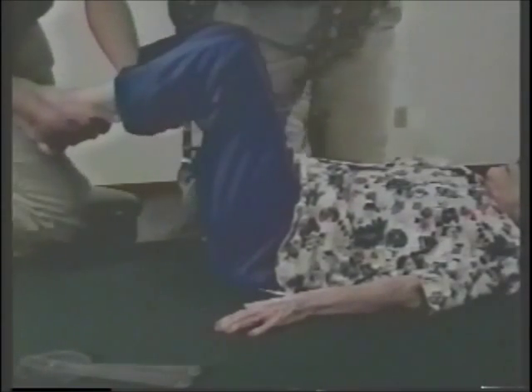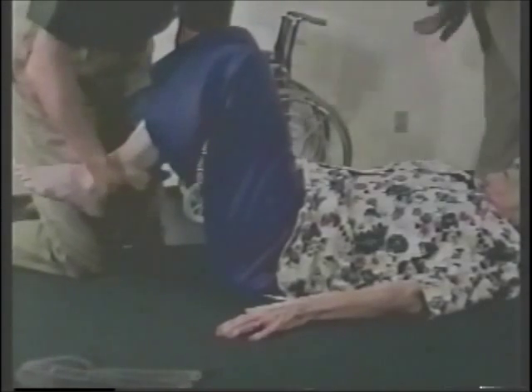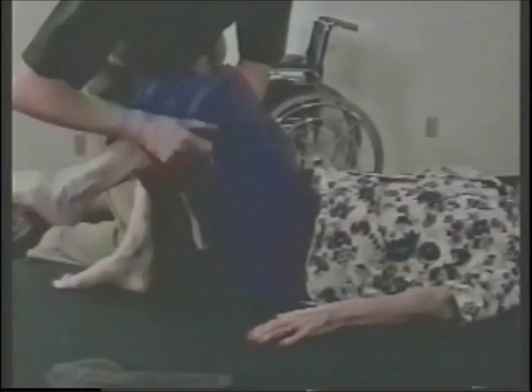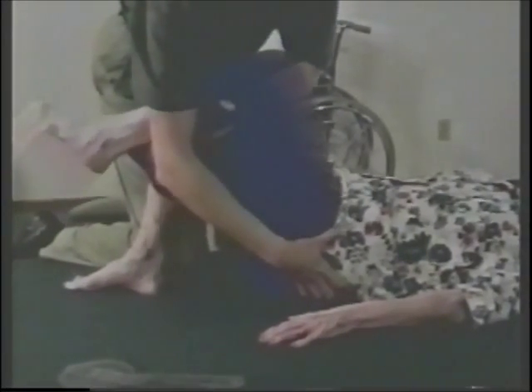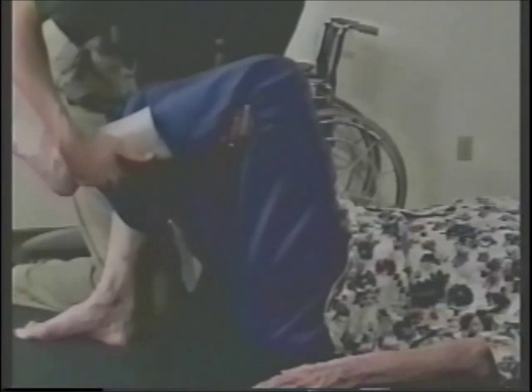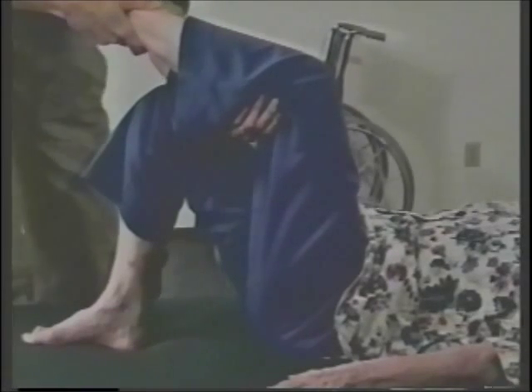The next part of the evaluation is looking at the knee range of motion. I make sure the hip is in the same position that we measured, then putting your hand behind the knee on the hamstring tendons, letting the leg relax down, and I'm going to come up nice and slow and determine your hamstring length. Then I'd ask Bob to help hold this leg in position so I can measure.